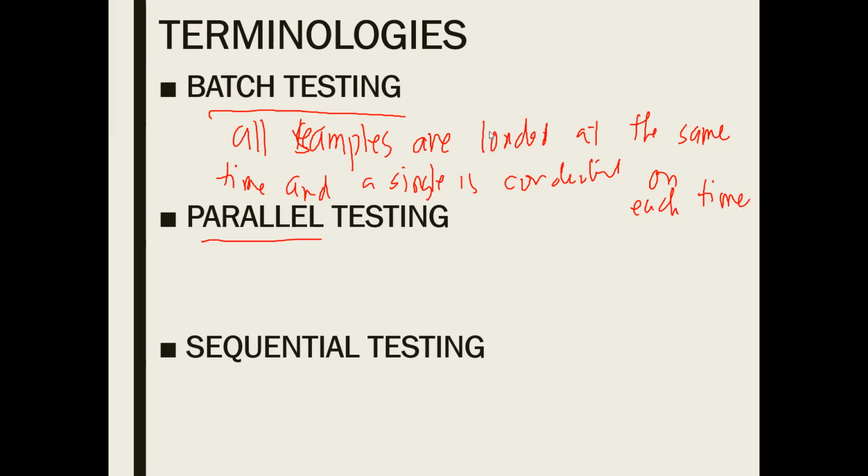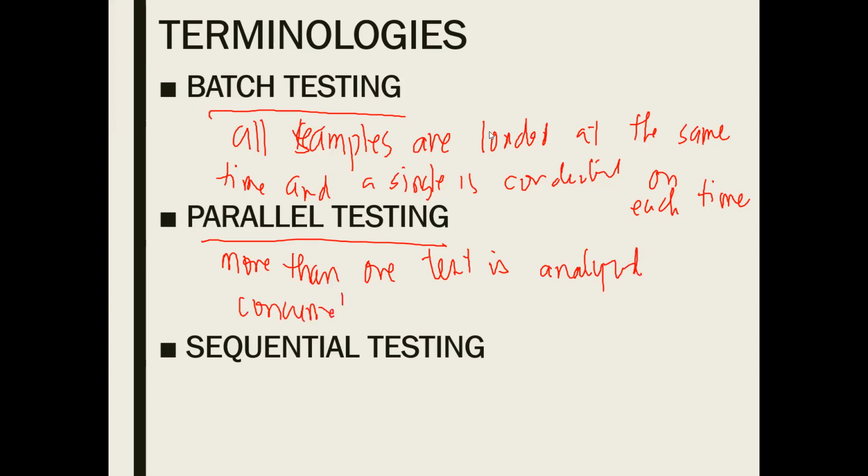Kapag po sinabi nating parallel testing, more than one test is analyzed concurrently on one sample. Kumbaga, ito pong batch testing, kung may 10 kang sample at lahat ng 10 sample na yon ay may BUN, yung BUN po muna ang itetest sa lahat ng sample na yon.